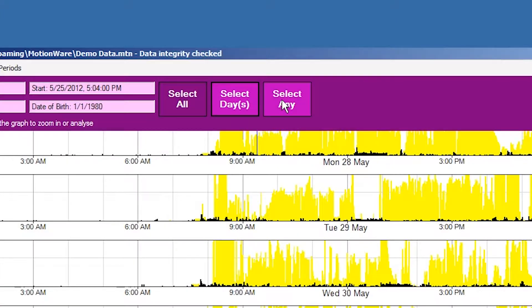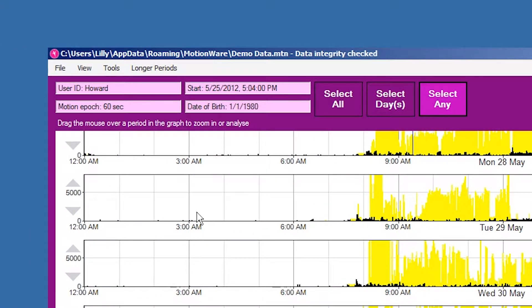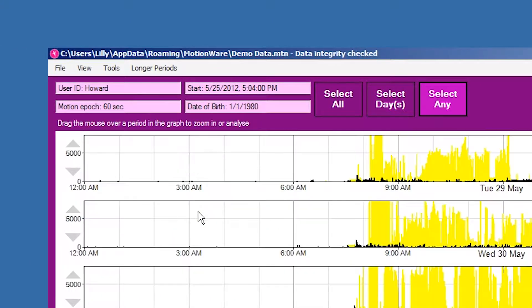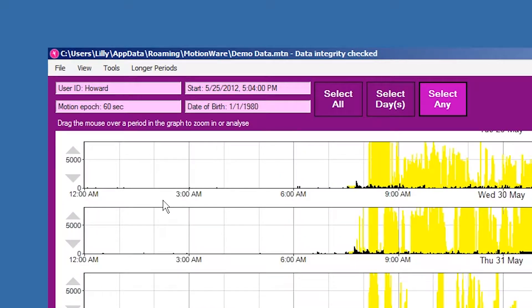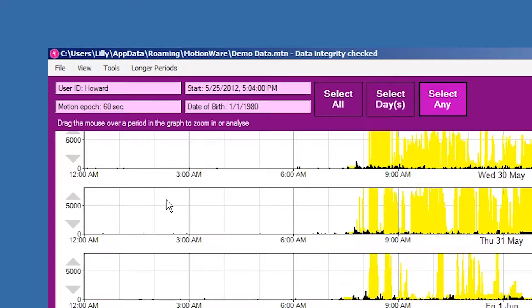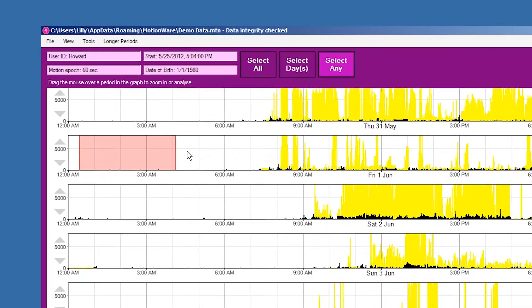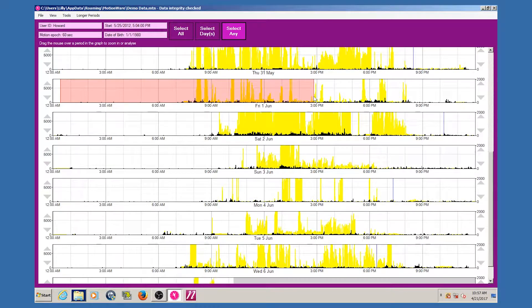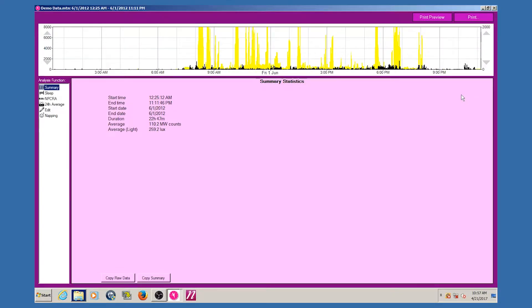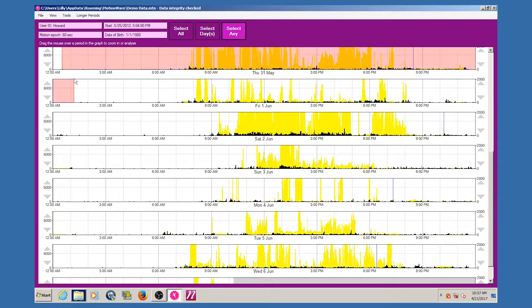The select any option provides a flexible means of selecting any analysis period between your chosen start and end points. In the motion-wise window, choose the period of data for analysis by pointing at the start point. Hold down the left mouse button and then drag to select the period required. The selected period is highlighted and the analysis window is automatically displayed. It is possible to select a very short period or several days using this method.